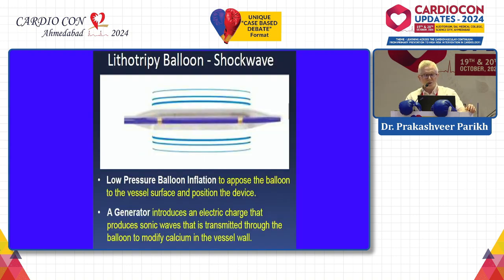And the latest addition is the lithotripsy balloon, in which there is low pressure balloon inflation to oppose the balloon to the vessel wall. And the generator introduces electric charge, which will produce sonic waves, creating almost 50 or 60 atmospheres of pressure in the artery that is transmitted through the balloon, and that is an excellent device to modify the calcium in the vessel wall.